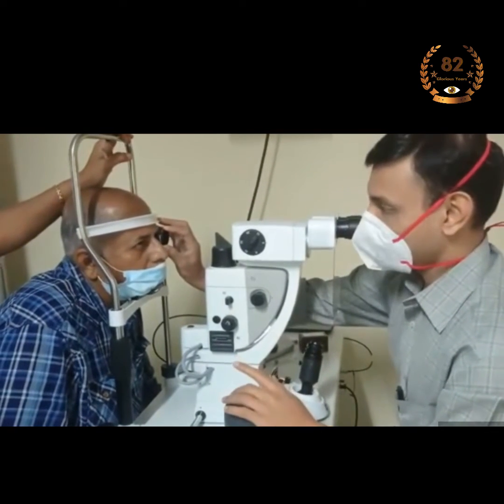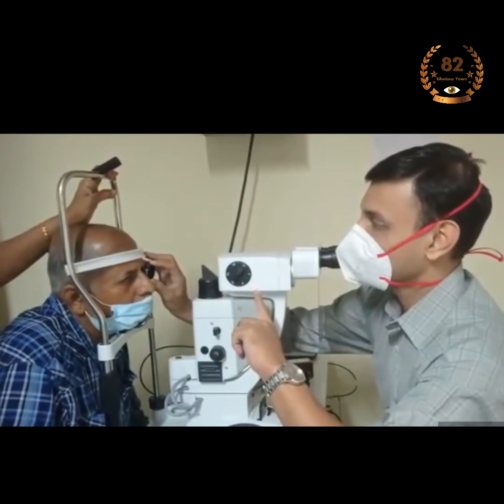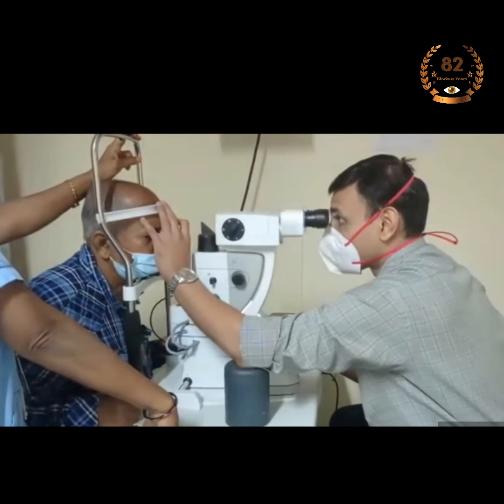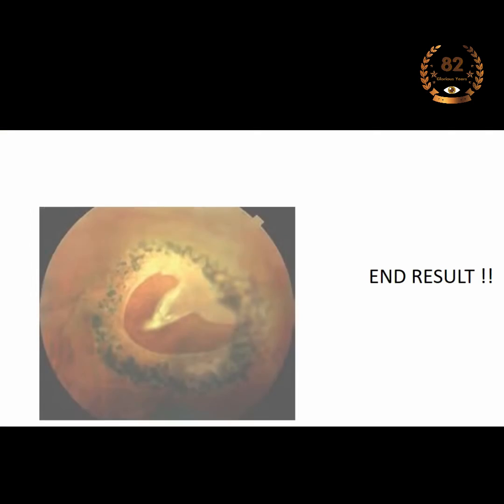During the procedure, the patient will see repeated light flashes and also experience stinging pain at some sensitive areas. The whole procedure is over in a short time. There will be some residual pain at the end of the procedure for which we give painkiller drops and tablets. And this is how the area of laser will look after scarring, a few weeks after the procedure.